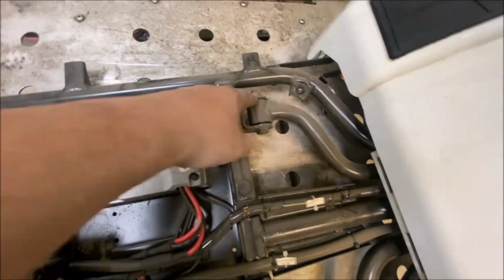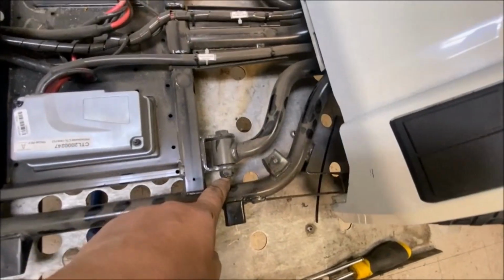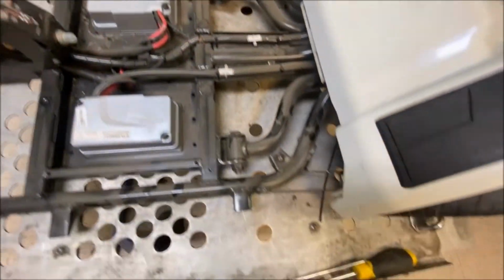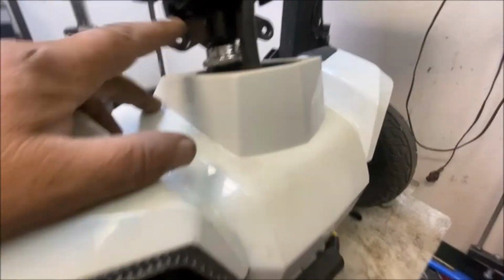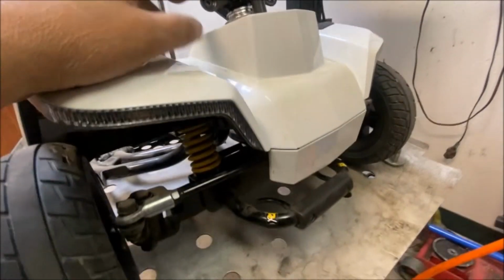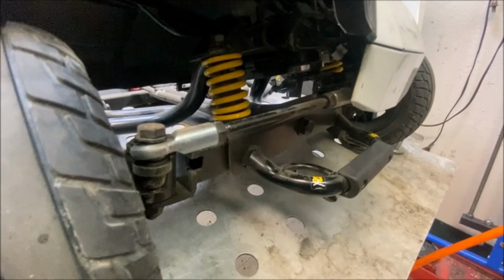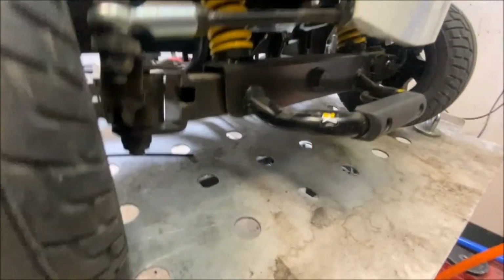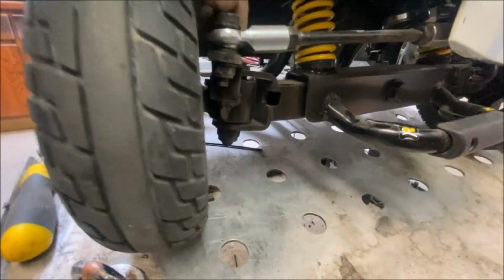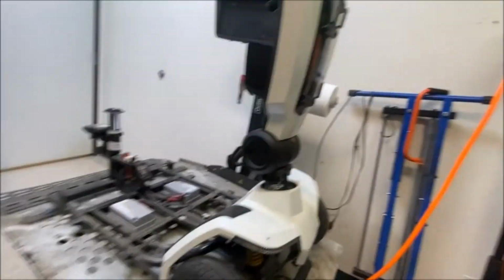So yeah, I just wanted to get it removed so I can check all the articulation points, just make sure nothing's come loose. Give it a clean up, give it a dust, and then I'll pop a little bit of Loctite on there just so they don't back off, because I know it goes over quite a bit of bumpy ground. I'm not going to remove this because that would mean removing the whole tiller. I'm not going to do that. Just moved it out of the way so I can physically check it, make sure nothing's bent in there, and get in and check all the nuts, make sure the steering's not worn and nothing's come loose. And I'll take the wheels off and go from there.